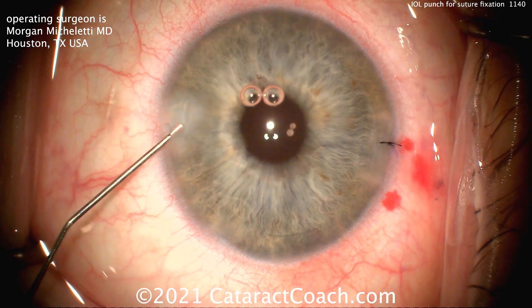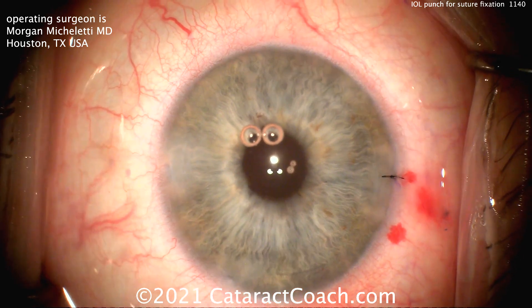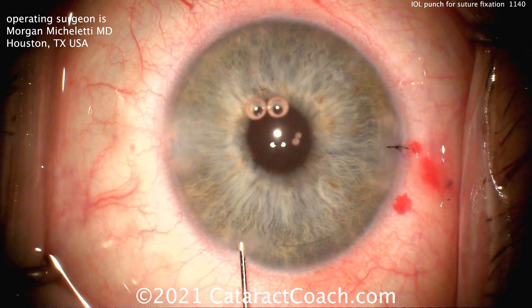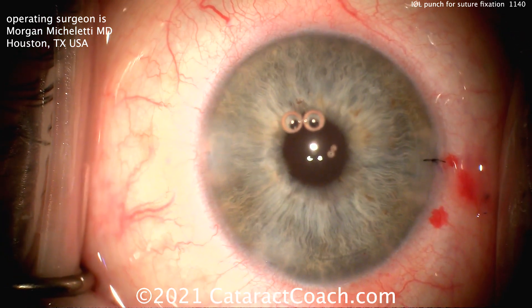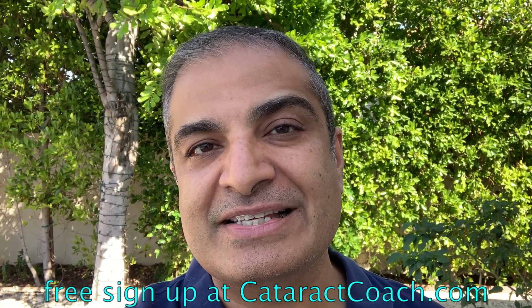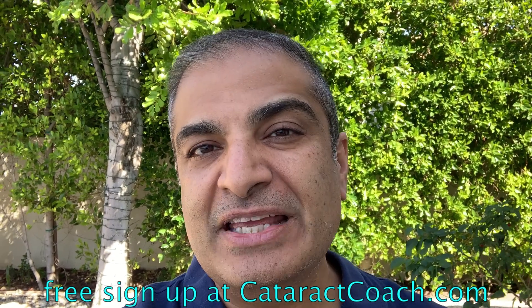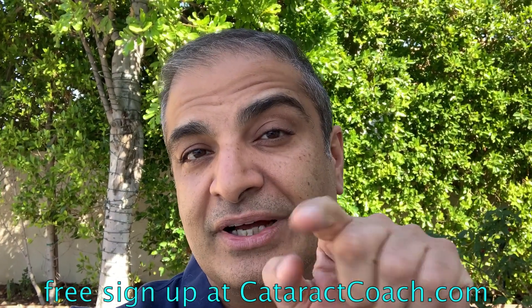This is a new instrument — I haven't seen anything like this before, and I applaud Dr. Michelletti for designing it. He says it'll be commercially available in the very near future. If you have a case like this, perhaps the punch technique using this special instrument is an appropriate method to salvage the existing lens. The post-op figure shows very nice centration. Thanks for submitting your video — remember to go to cataractcoach.com and sign up for a free daily email with great videos and surgical pearls.